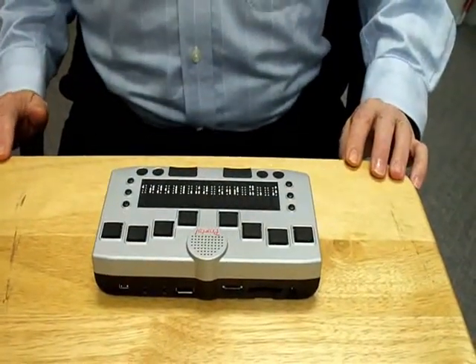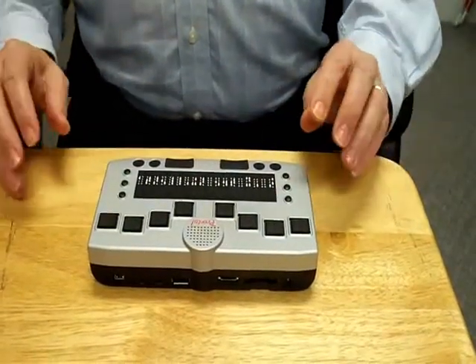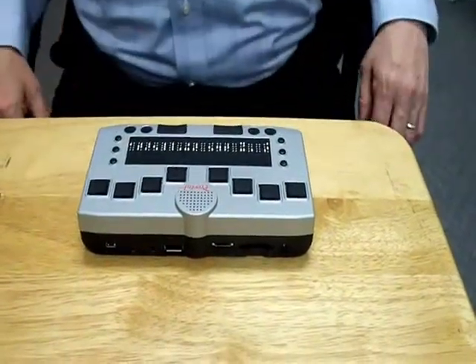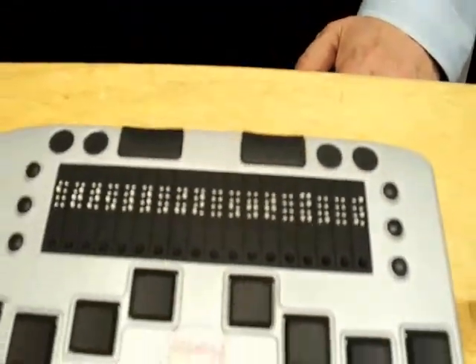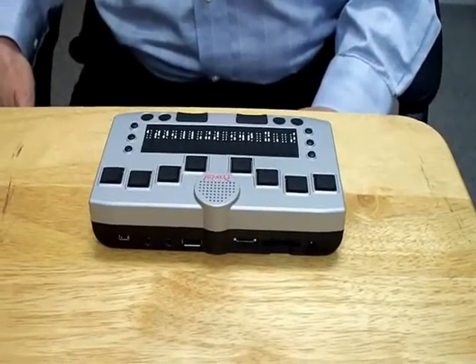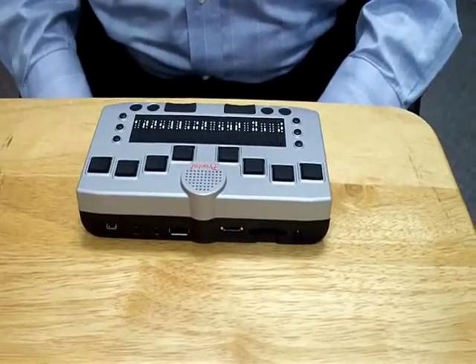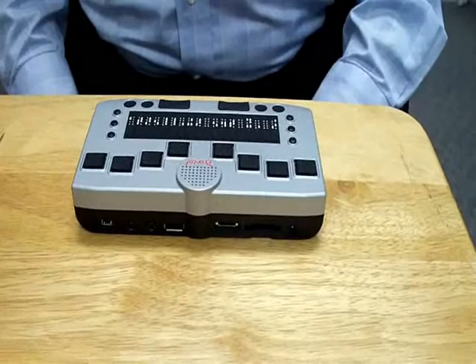The right one is what you use to actually do the space. And finally, you'll notice that there are, at each end of the unit, right next to the two space bars, some slightly inset circular keys. They're numbered from left to right. The very left one is S1, and S2 is right next to it. Then we pass over the space bars, and we come to S3 and S4. When I'm done describing the unit, I'll give you an example of some fun things that these keys do to end off this particular tutorial.